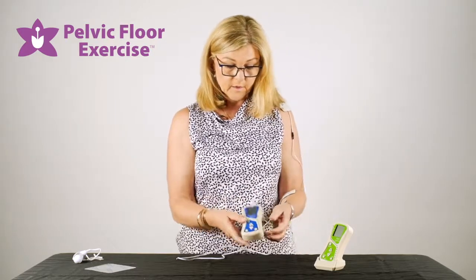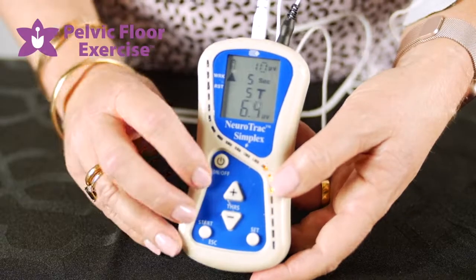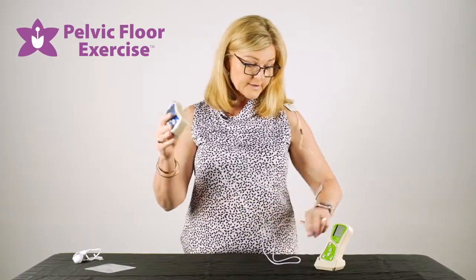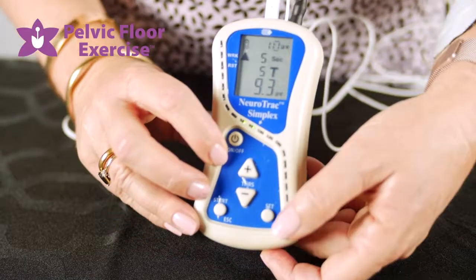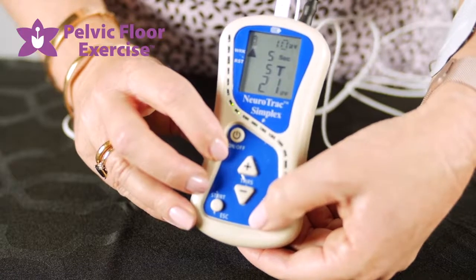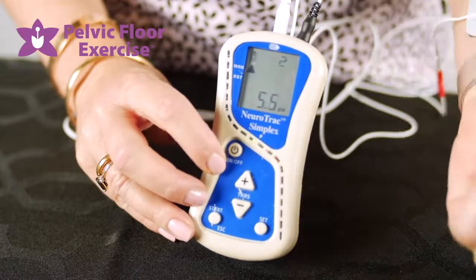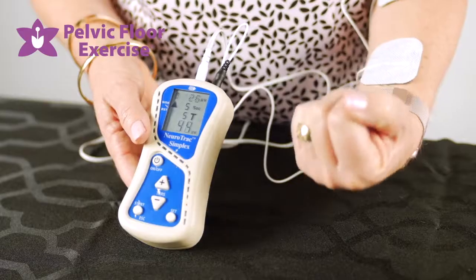We now turn the machine on with the on/off switch and we need to set our threshold. These machines do an automatic threshold, so if we press the SET button you'll see on the screen some numbers counting down from three, two, one. We're holding for that time and releasing.